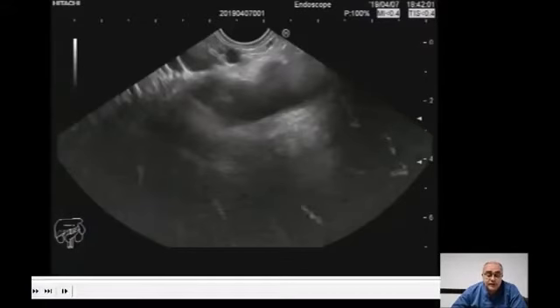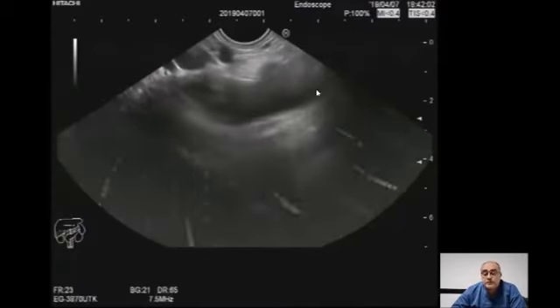We come back to the midline to visualize the aorta again, and then we start to do very important maneuvers, which is anticlockwise, to visualize the head of the pancreas, CBD, and the pancreatic duct, and then clockwise to visualize the left kidney, spleen, and suprarenal. Now we will start to do first anti-clockwise maneuver.